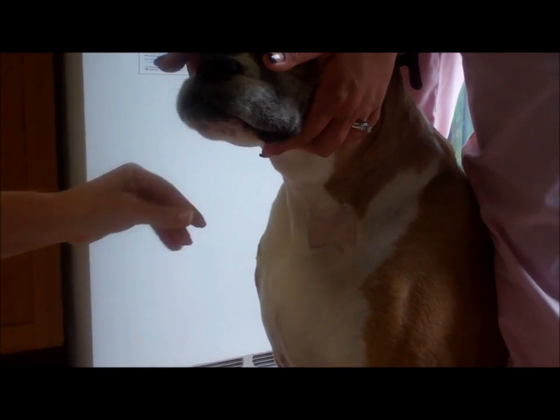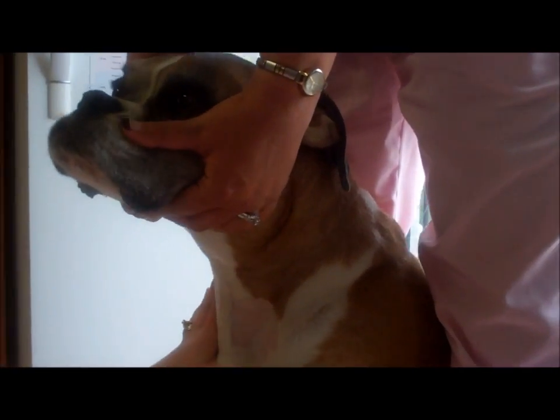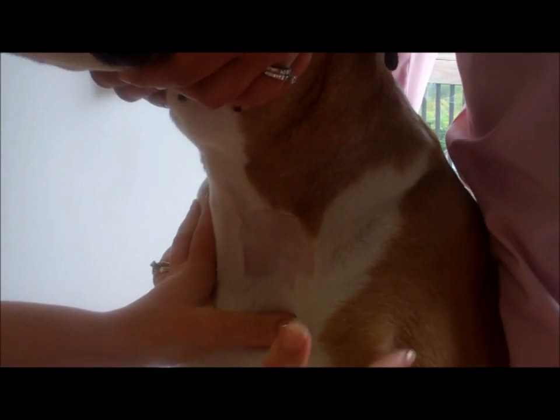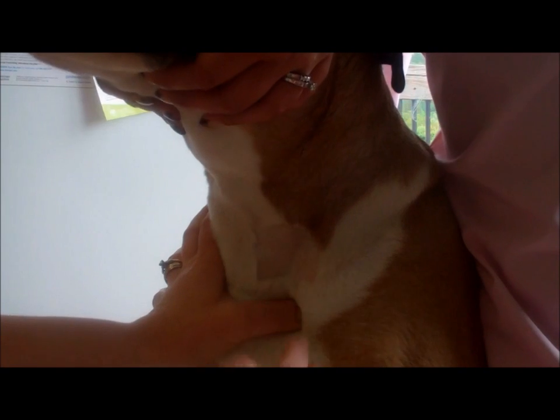As you can see the way that Mason is being held now, if I push my thumb — you want your thumb to be in the jugular furrow and you need to push fairly hard. Especially since Mason tends to be broad-chested, you need to push in and up in order to see the jugular vein.